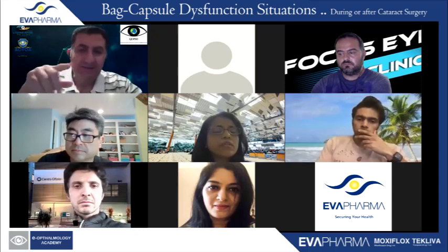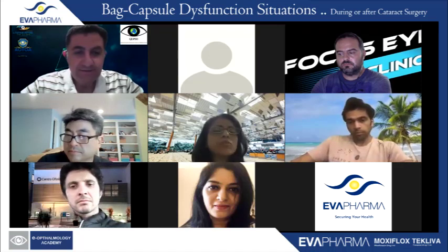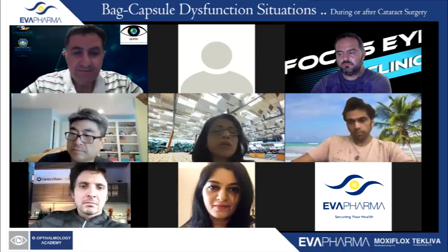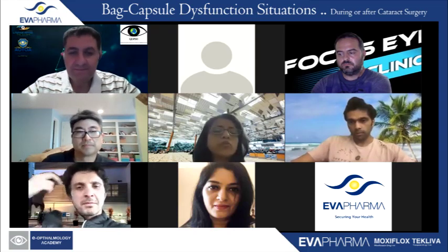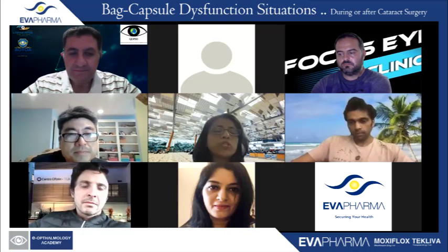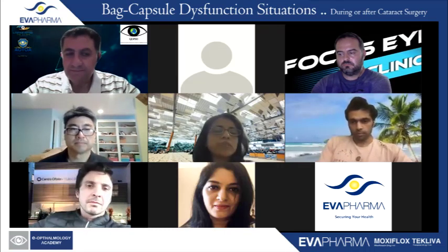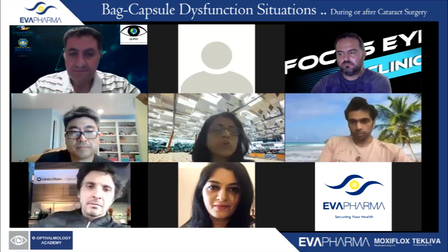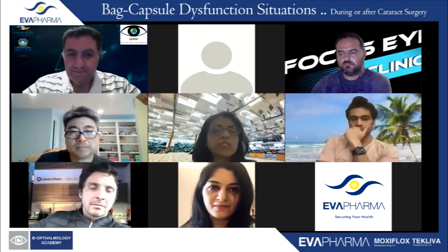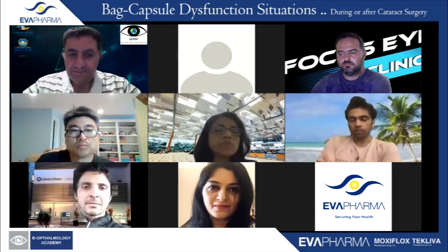Does it affect the endothelial count? No, because you're still in the posterior chamber. You're not in the anterior chamber at all. You're in the posterior chamber, so the endothelial count is not affected at all. You don't get endothelial decrease in posterior chamber phakic IOLs, even though that's anterior to the lens plane. That doesn't happen unless you're in the anterior chamber. You wouldn't expect an endothelial cell count decrease unless it comes from your surgical manipulations.